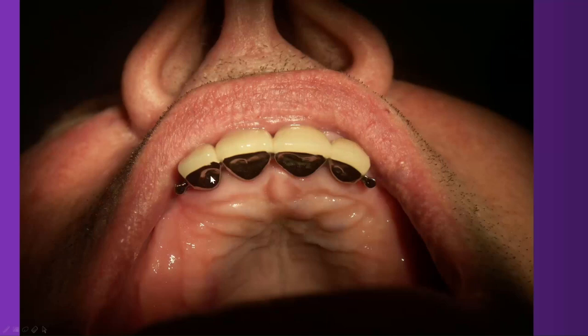So after 8 years, the teeth were still there, and we do the same now, but with vertical systems. They are without milling, without arms and shoulders. It was the maxillary again, so we could do that, because the palate would limit the distal sinking of the denture.